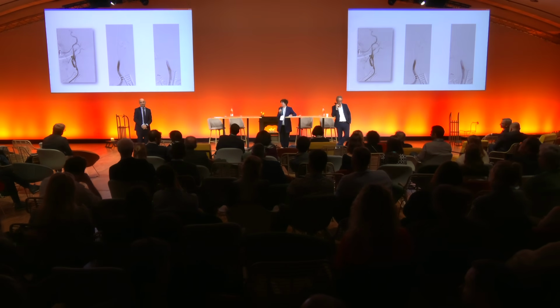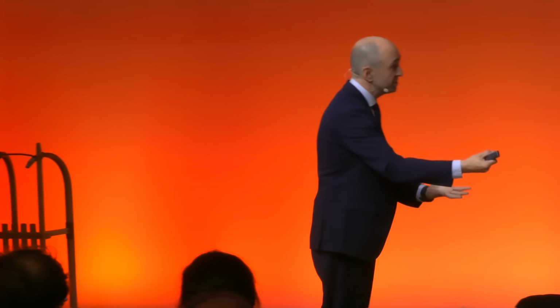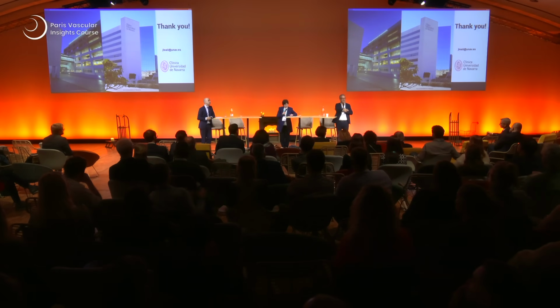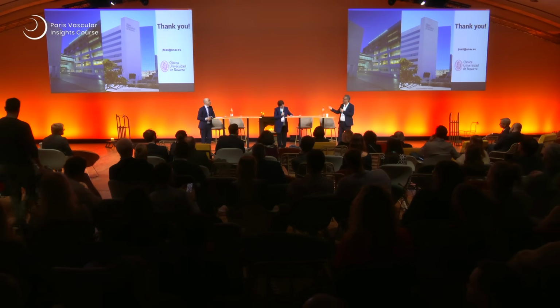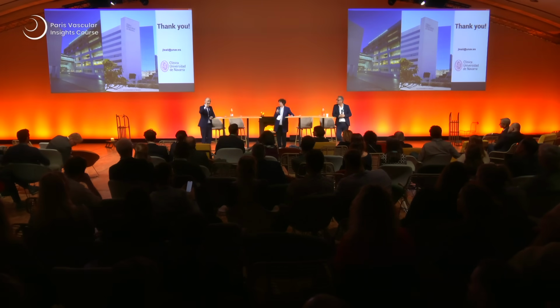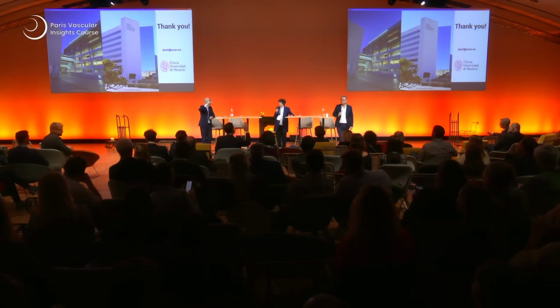Yeah. But I think the message is, for patients like this one, you need to have as many tools in your armamentarium as possible. We always have the patients that push the limits for us, and we need to try to make the right decision. Fantastic case. Thank you. I think that the main message could be prepared to change the option. You may start by transfemoral. You may also skip to the radial or brachial. Make the decision, evaluate the access, first option, second option, third option, and be ready for that.